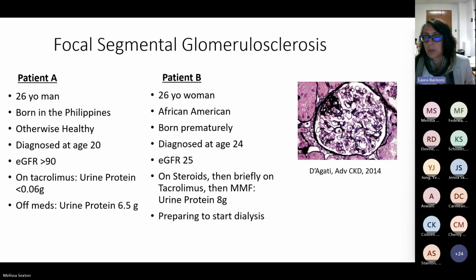Why do we want to have that? Because in the past, we would have to have local pathologists review their slides and tell us what it was. Nobody could really QC. It was just the opinion of one pathologist. Or the slides would have to travel from one place to another pathologist, to another pathologist, to another.